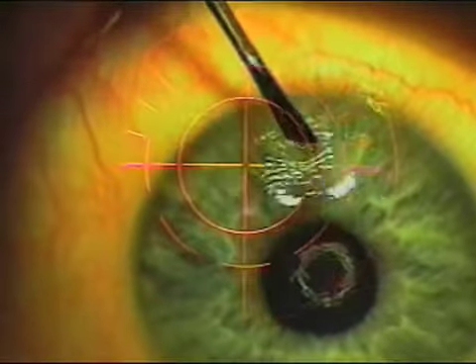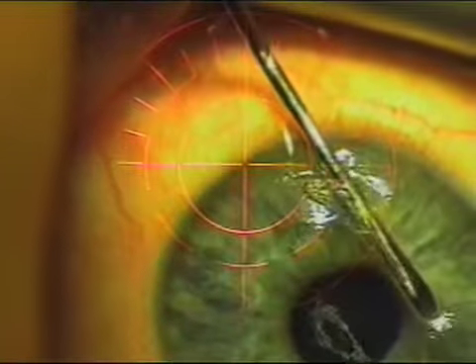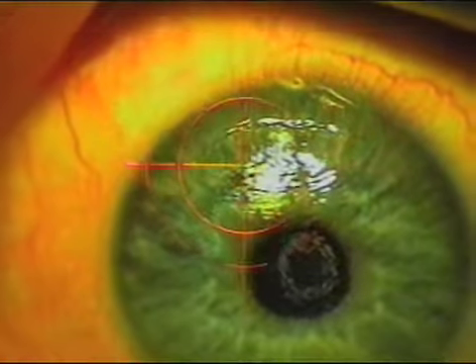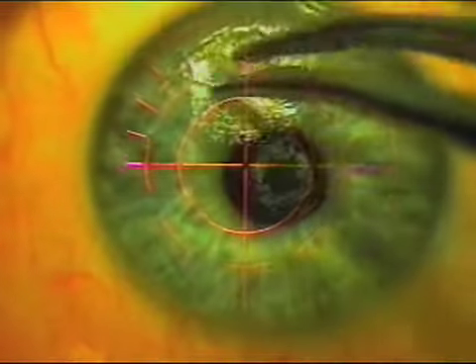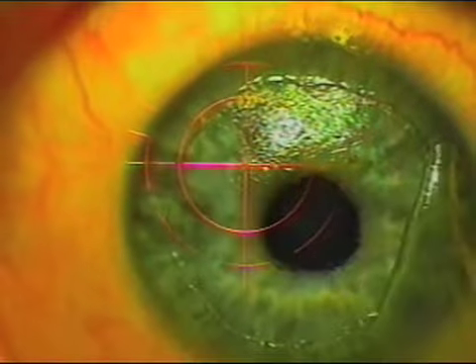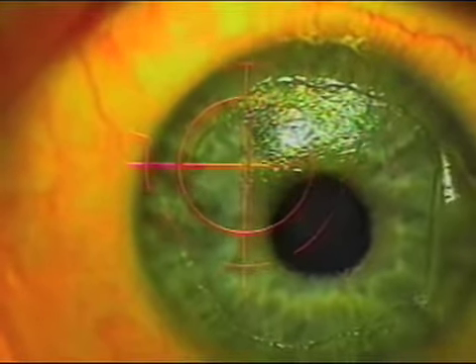And so then I'll take a lamellar dissecting tool, and you need one that's fairly thin to be able to get in underneath that flap edge and try to break the central adhesions. And if you're going back for an enhancement relatively early, breaking the central adhesions is not quite as crucial, like if you're going back at a month or whatever. But as you get further out, towards a year, year and a half, then it's very important to break those central adhesions so that you don't tear the flap with the flap lift. And then I'll grab the flap edge with a Hoskins forceps so that it's not too toothed, and then I'll lift the flap edge, trying to very carefully cleave the peripheral epithelium in this specific case here.